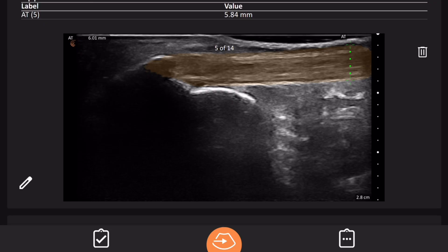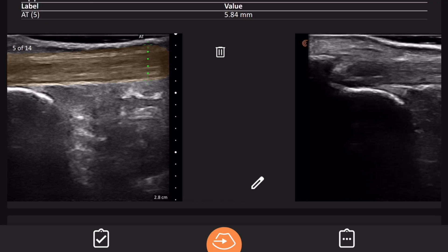Before, I was reaching over, the transducer slipping around, losing where I was, pressing the freeze button and then having to self-measure — and it's never that accurate. But with the AI mode, it highlights nicely and takes an accurate measurement at the thickest point of the tendon. Often I like to take away the orange marker and just keep the normal picture, because I want to show them what's going on within the plantar fascia — whether there are micro tears, thickening, calcifications, or a heel spur. Sometimes I'll take away the AI mode so the patient can see as well.